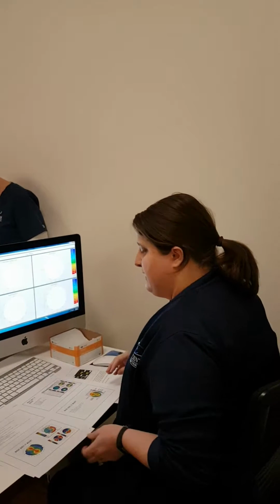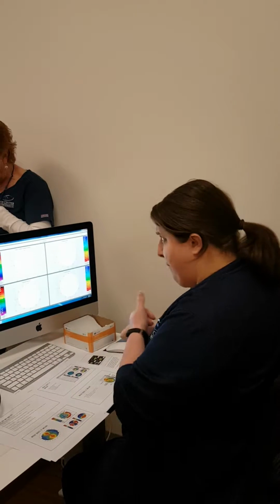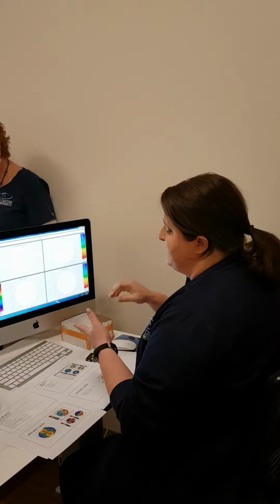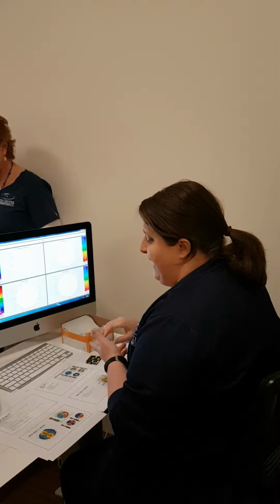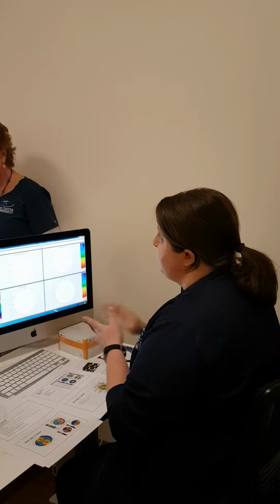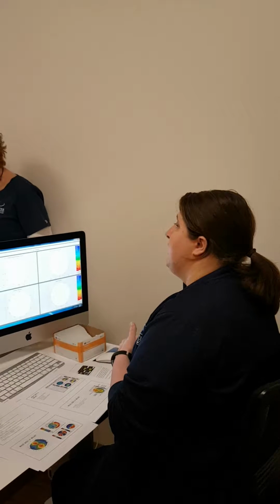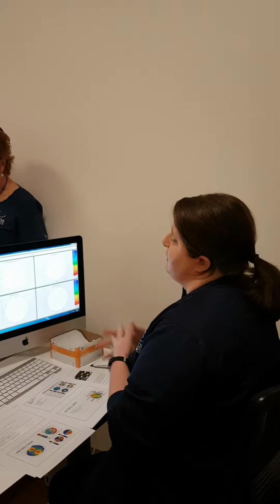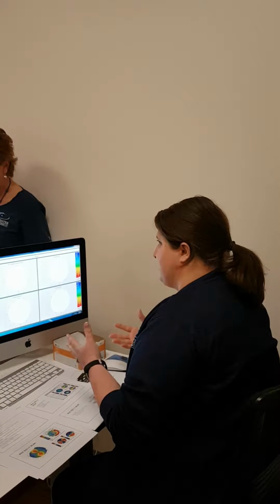Let's see, why do we do it? Again, I went over this a little bit. Keratoconus is probably the one that everybody knows about. Irregular astigmatism. Keratoconus is a form of irregular astigmatism. And we do it for refractive surgery and preoperative for cataract surgery, so that the doctors can screen for that type of irregular astigmatism, so they can make an educated decision with the patient about what they can expect after surgery.